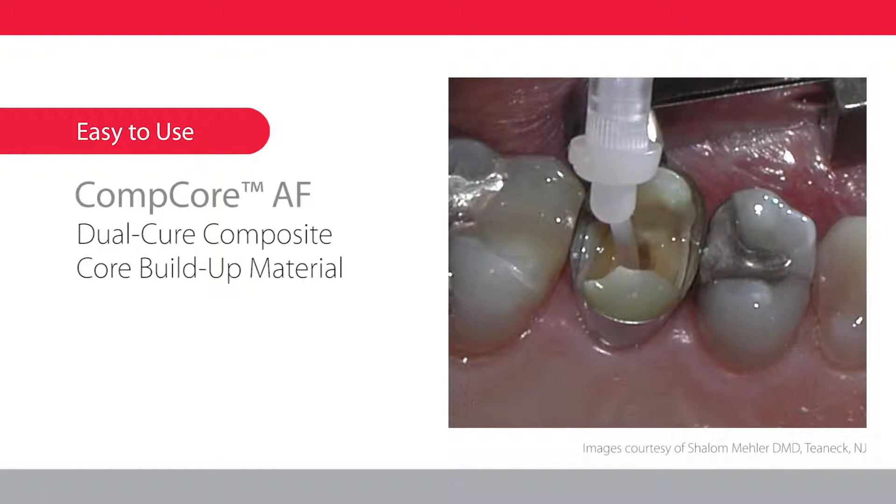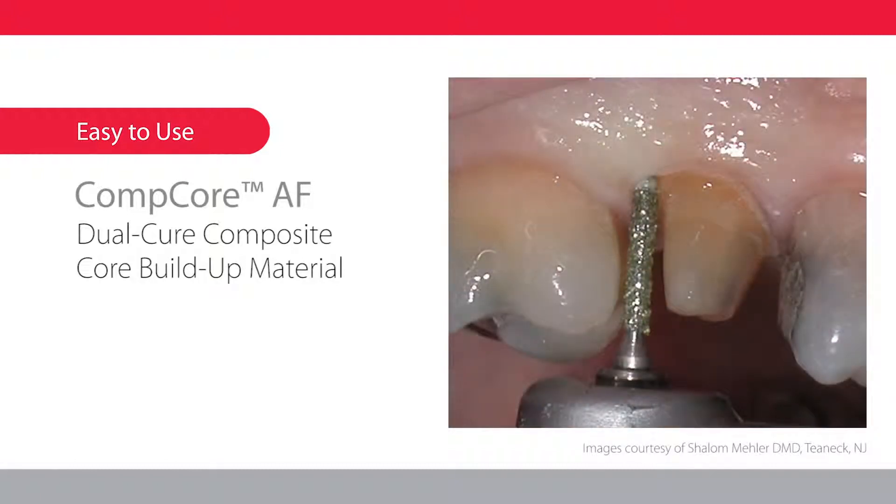If using shades A3 or white, light cure for 30 to 40 seconds. Alternatively, the core can be chemically cured in four and a half minutes intraorally. Check for complete hardness. The preparation can be finished immediately.